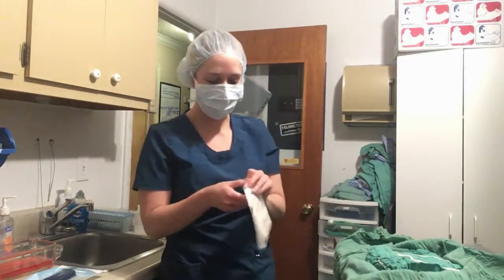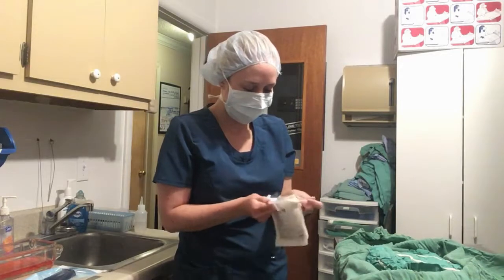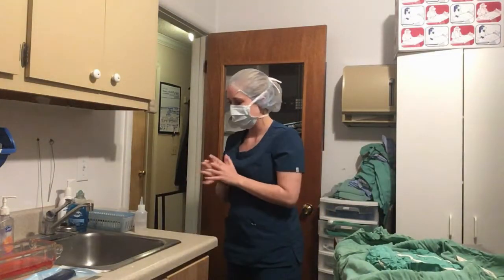And I'm going to go ahead and open my gloves. Make sure to really keep everything sterile.